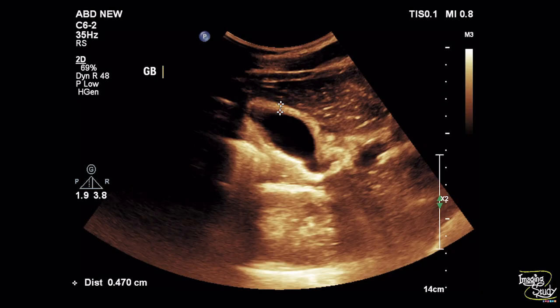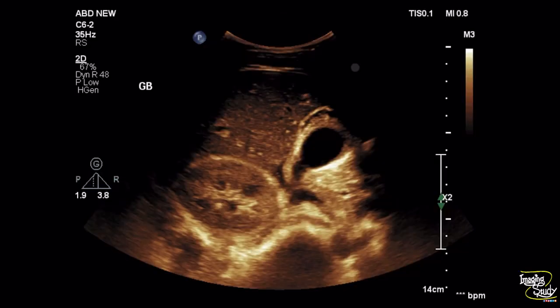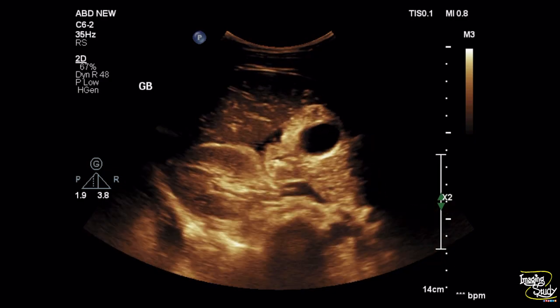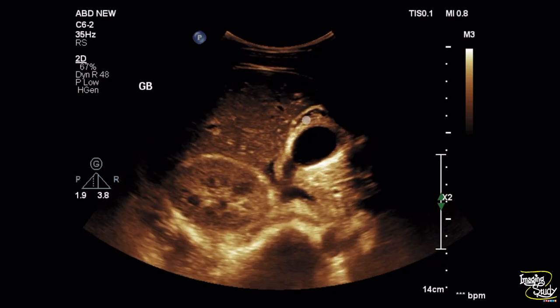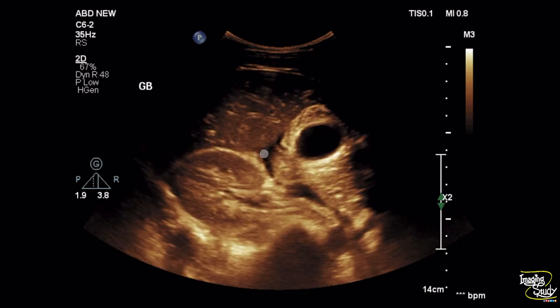The wall thickness was about 4.7 millimeters. The normal wall thickness we know is less than or up to 3 millimeters. The pancreas looks normal. This is another wall thickness measurement from a different location which is 5 millimeters. This is another picture of the gallbladder of this patient and the gallbladder wall looks edematous.